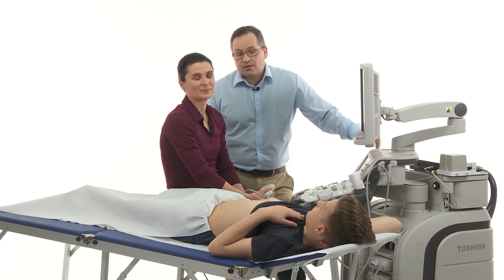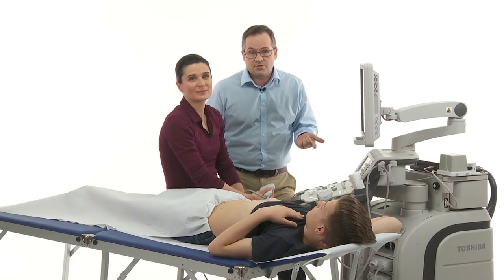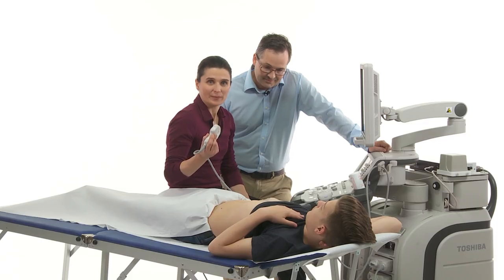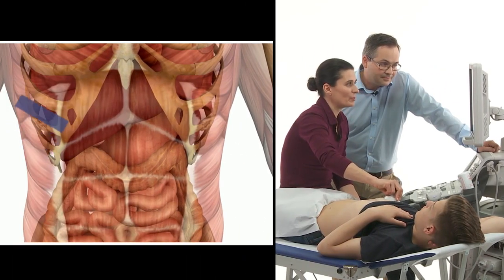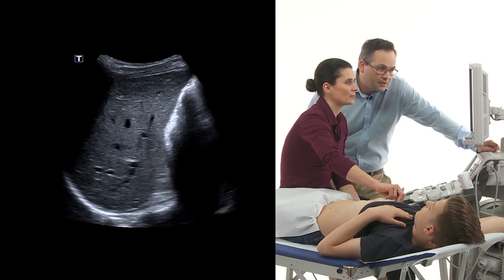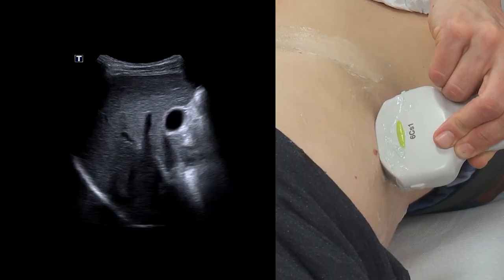And we are asked, are there gallstones? Is there a biliary obstruction? And how does the liver tissue look? So we have another scan for this question. I can perform an intercostal scan. I place my transducer into the space between the ribs, in the intercostal space, and there I can get a view of the liver tissue itself. And I can also tilt my probe in this position.